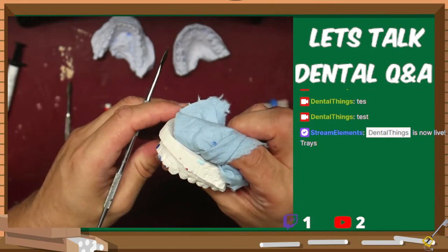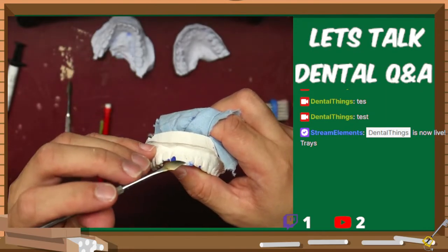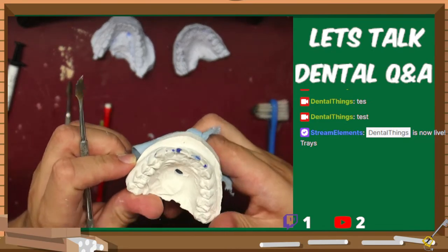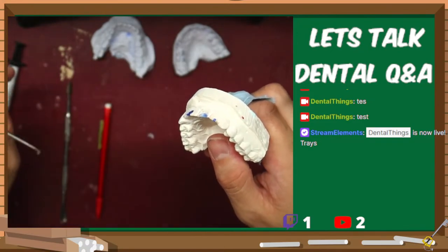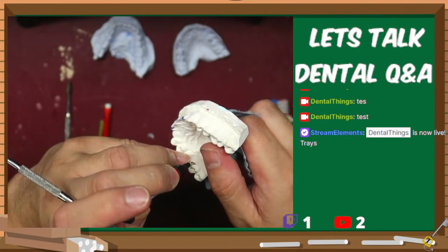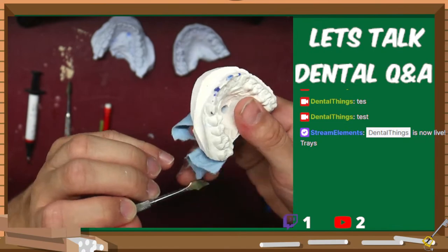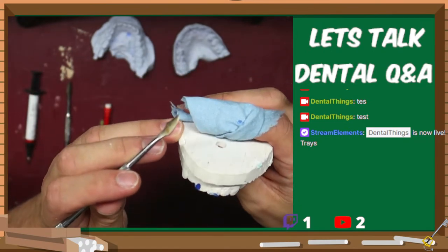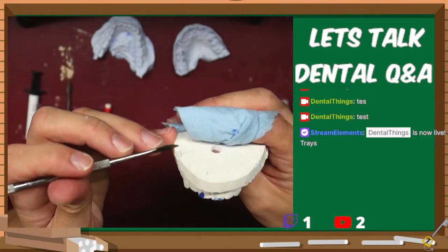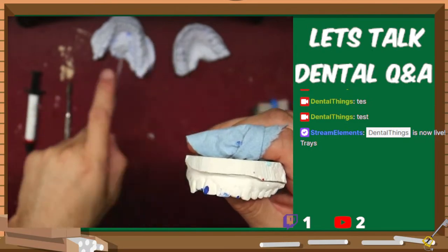What other breaks do I have in this? So it was mainly that one. I might have that little small point right there. And I think that should be good. Let's go and hit that with the light cure then.